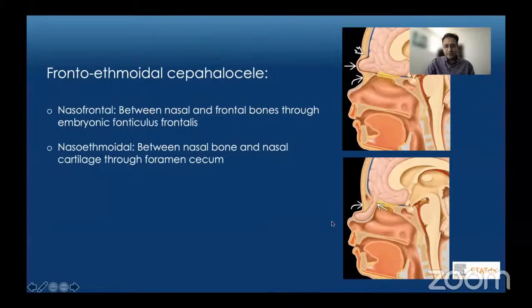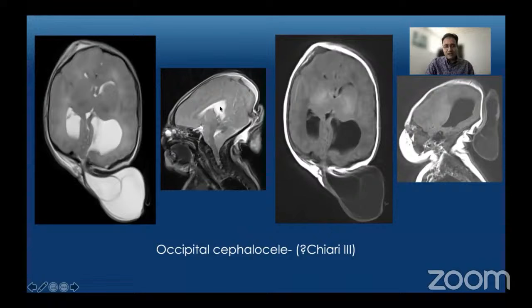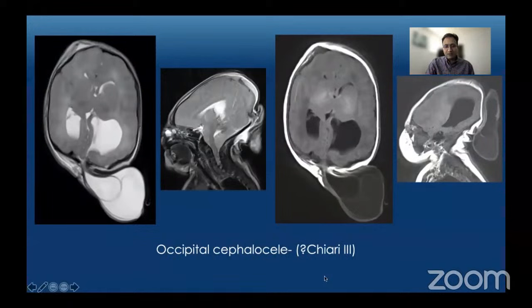This is an example of occipital encephalocele: a large bilobed cystic mass arising from a defect in the occipital bone with possible brain parenchyma herniation. Intracranially there is effacement of extra-axial spaces, mild ventricular dilatation, and abnormal posterior fossa morphology including a small posterior fossa, effacement of the cisterna magna, inferior herniation of the cerebellum, and crowding at the foramen magnum. These findings are reminiscent of a Chiari 2 malformation, but when an encephalocele has Chiari-2-like findings it is called a Chiari 3 malformation.